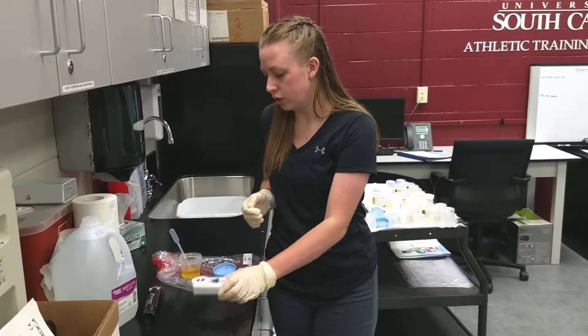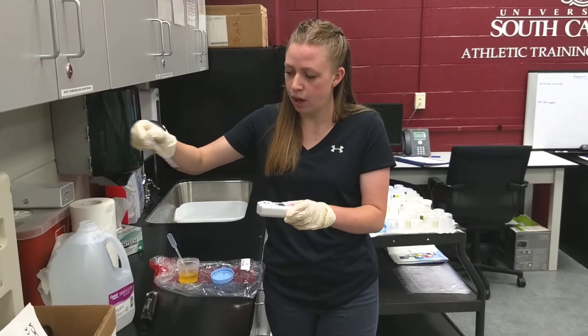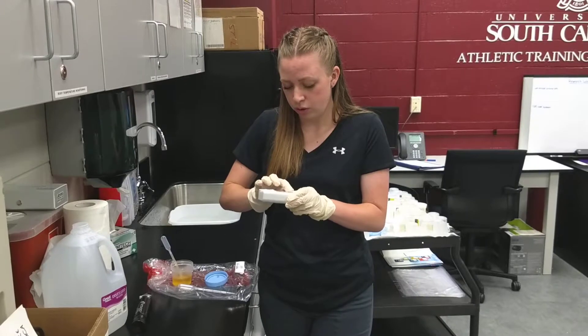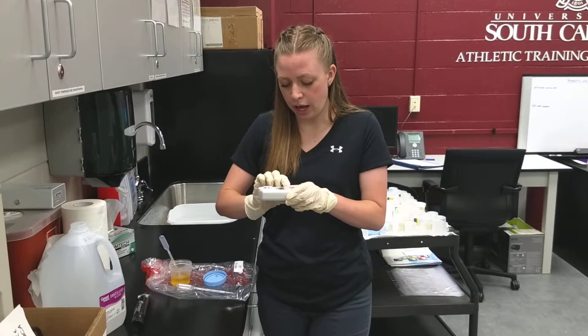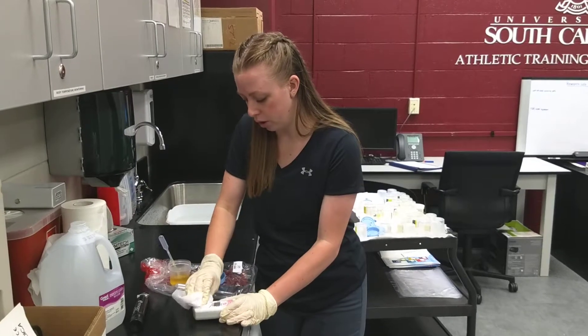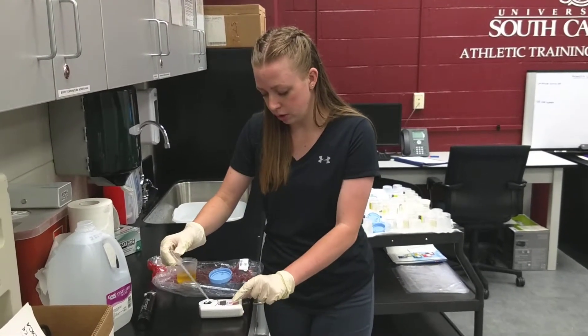To use the digital refractometer, you'll start with distilled water and place a couple drops onto the top. You'll then hit zero to calibrate it and wipe off the water. You'll then place the urine sample on and hit start.